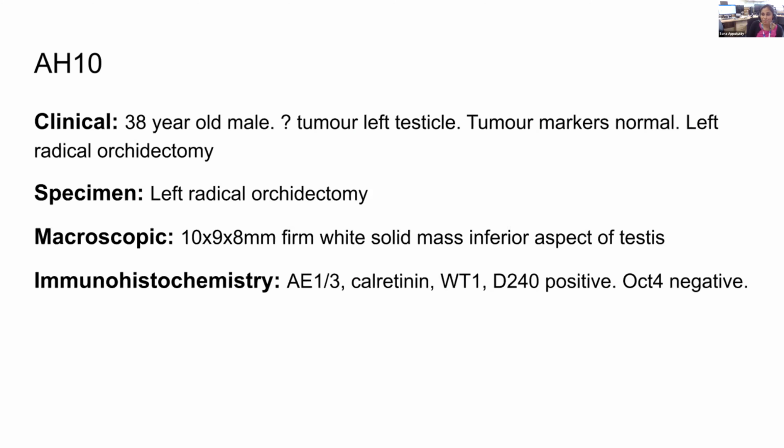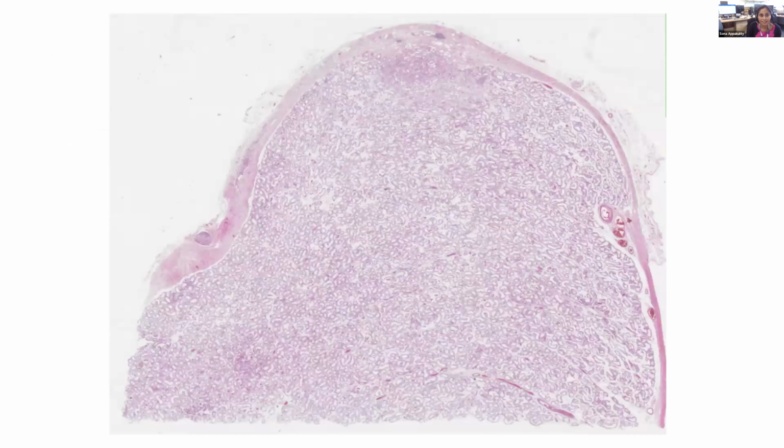I'm sure at this point most of us knew what it is, and probably just went into type 1 diagnostic reasoning and put the answer. But it's quite interesting. I thought this was the most interesting case, actually. Part of the testis with a lesion here. The background testis doesn't look very healthy.